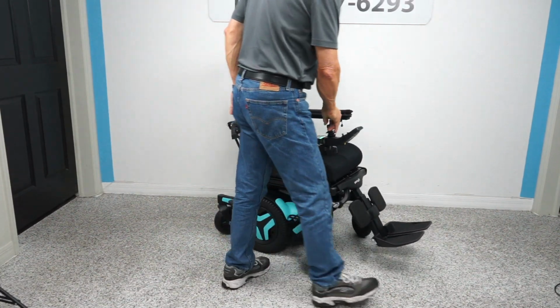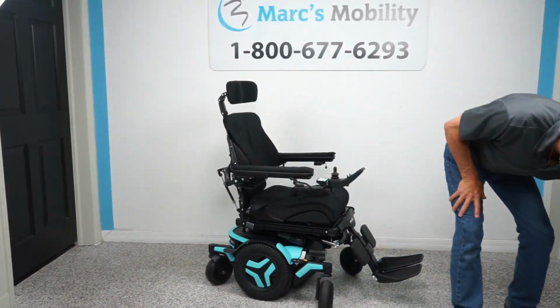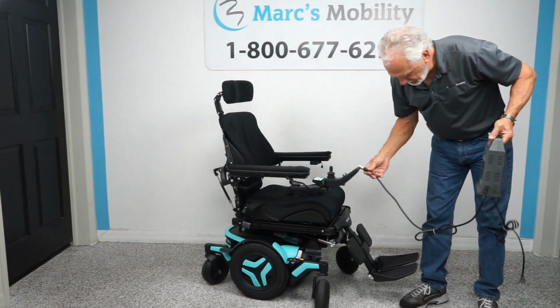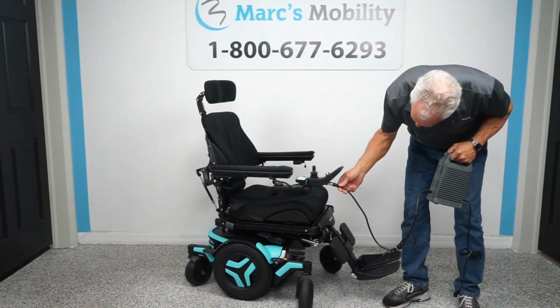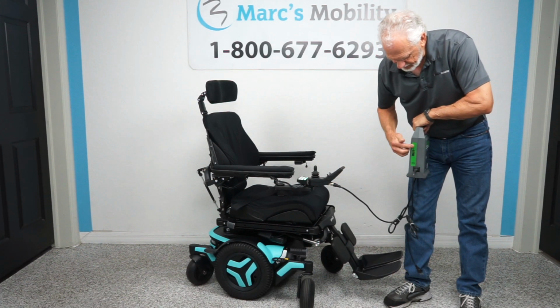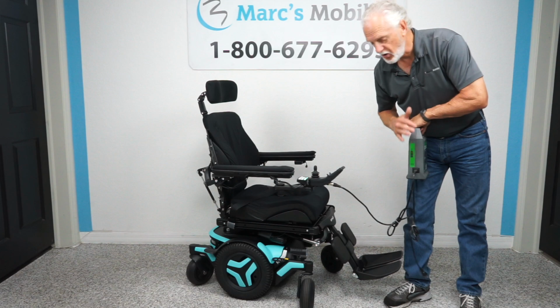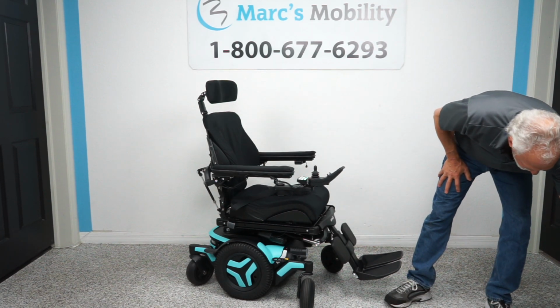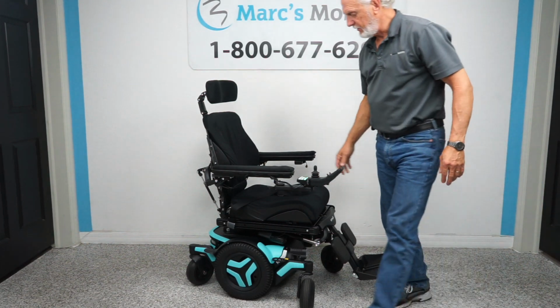When you charge the batteries in this chair, you'll take your Permobil charger. We'll use this one for example. This may not be the charger with this chair, but we'll use this one. This is where you plug it. As soon as the light goes to full or green or 100%, the charger will stop charging. These are smart chargers. They know when to stop charging.